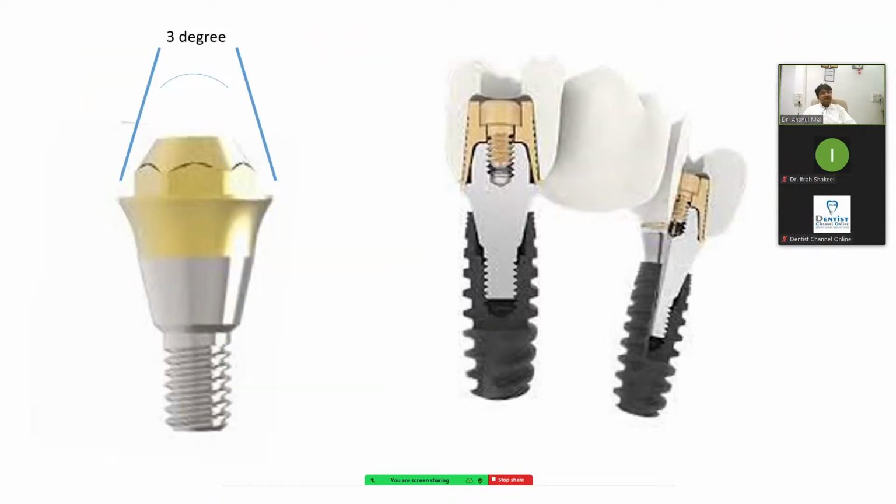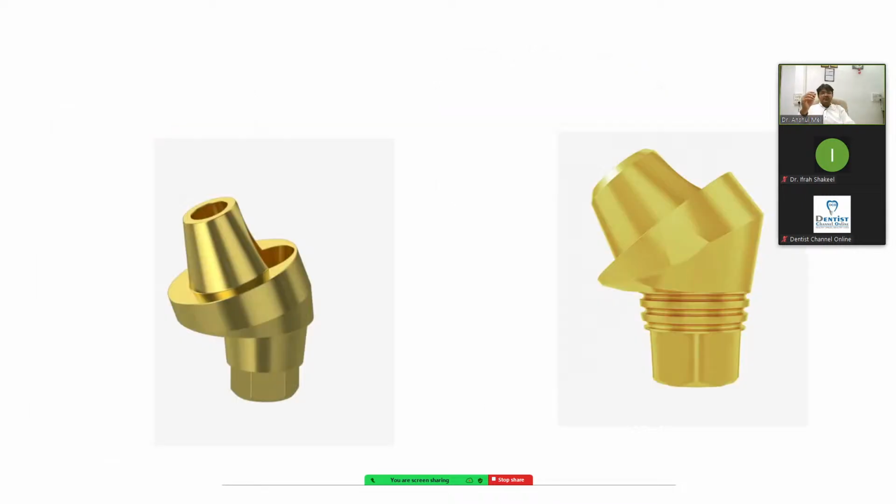The same way, the multi-unit. Multi-units have two units: one is connecting with the implant and the second unit is for the prosthetic, which is non-hex. Whatever forces come will be borne by the hex in the bottom, for example, you have an angle, so you have a hex inside of that. And the top part is the prosthetic, non-hex. So whatever the lateral force, anything will be on top. If anything happens to the small screw, it will fracture on the top. So it will not create a problem at the bottom. So your implant is always safe.